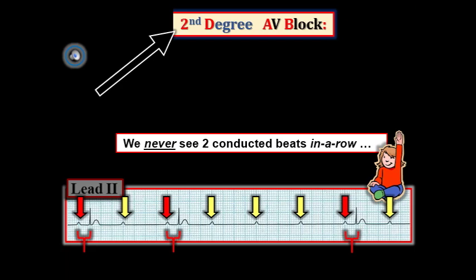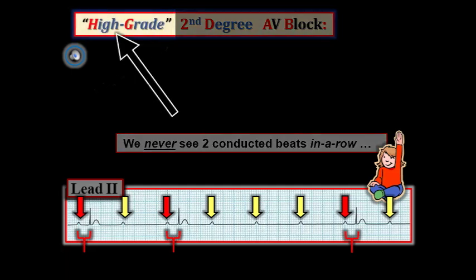That said, regardless of whether this example of second-degree AV block is Mobitz I or Mobitz II, consecutive non-conduction of P waves with the resultant slow ventricular rate produced here is of concern and may require pacing unless the ventricular rate can be increased. In such situations, we find use of the term high-grade AV block a convenient way to convey concern for selected cases of AV block that otherwise defy classification.